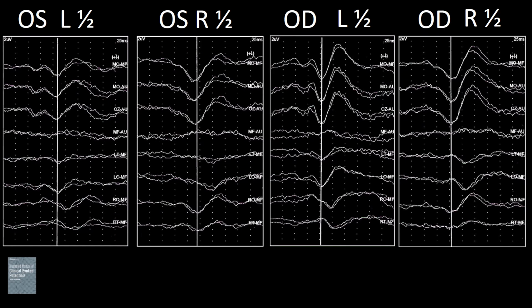You can see in this frame 4 panels as you did in the last question. Crossing the vertical and horizontal lines, you can determine the putative location of P100 and confirm its presence in the first panel.